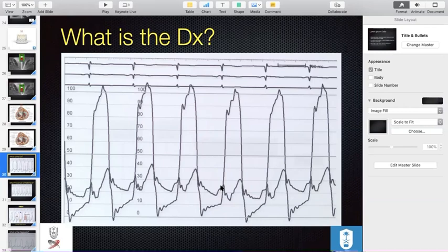Next, you want to see the peaks of those 2. Are they within the ST-T segment or not? They're not. They're not within the ST-T segment. Maybe the V wave is becoming within the T wave, as you see. But I can bet this is an atrial tracing, despite there being some variability, which is not against it. But I would say this is an atrial tracing. Okay. Then go to the second tracing.